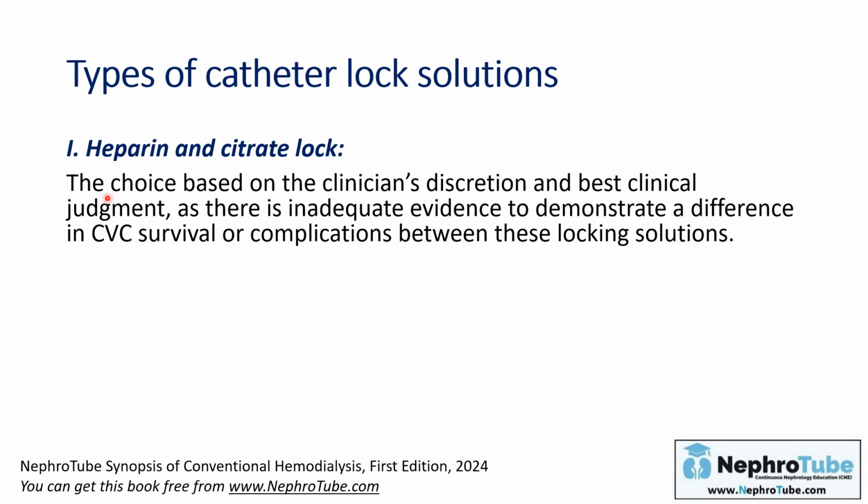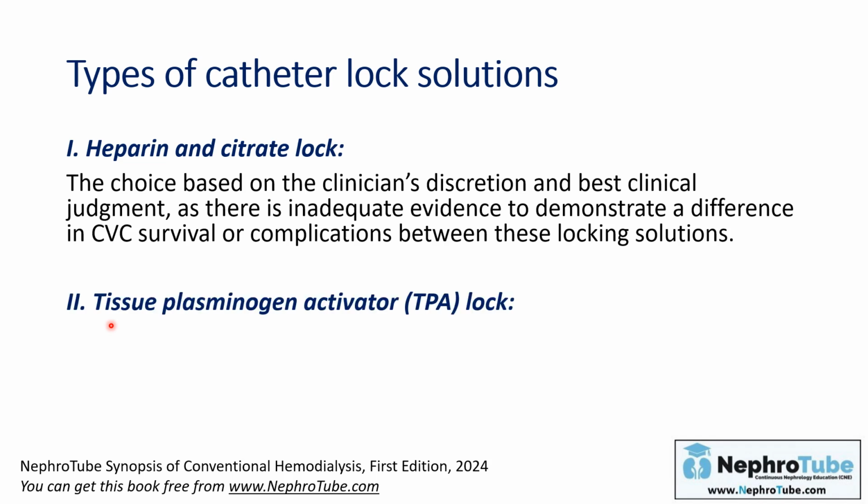The question now, which is better, heparin or citrate? There is no evidence or there is inadequate evidence to demonstrate difference between them regarding catheter survival or complication, so you can use any one available of them at your unit.